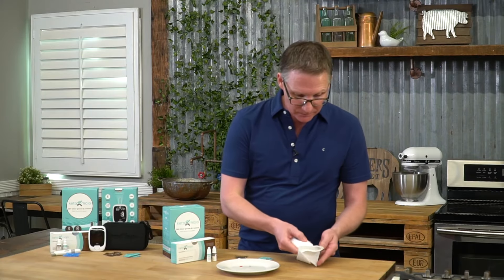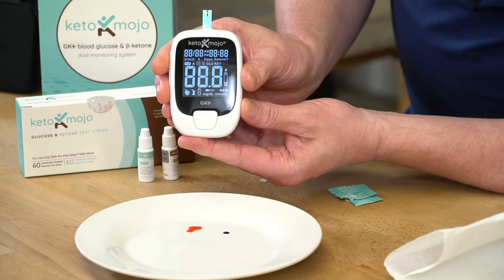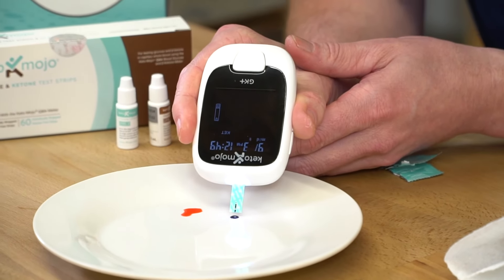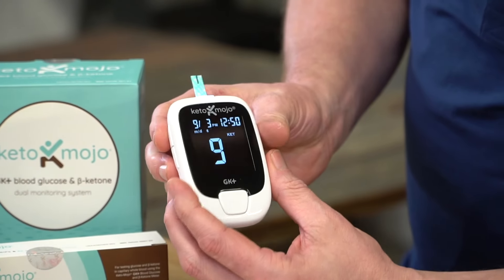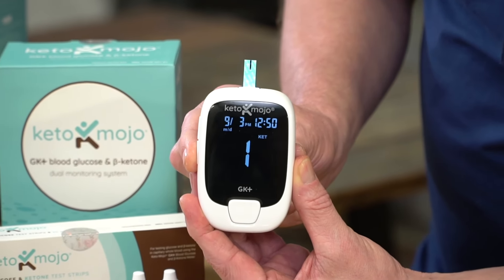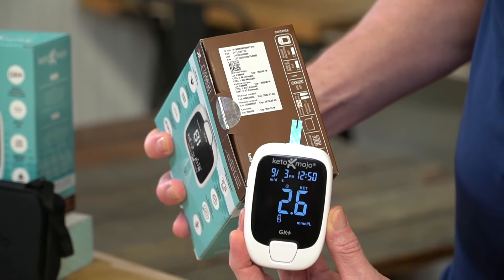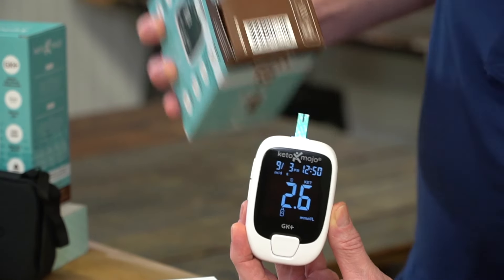Let's go and do our ketone now. Let's click that out, like so. Ready to test. Put that under the control, like so. In 10 seconds it will count down. 2.6 — level 2. Let's look at the bottom here. We can see ketone strips level 2 should be between 2.2 and 3.2. This is in range.